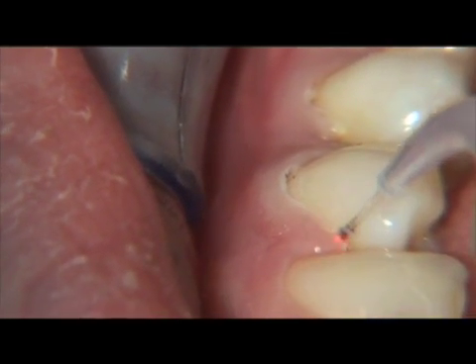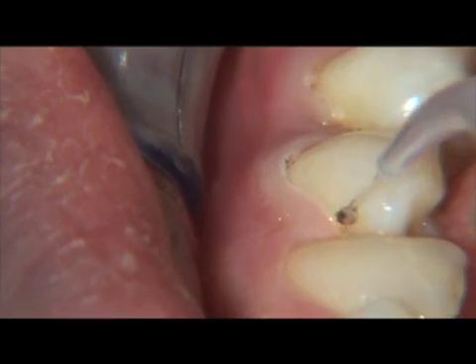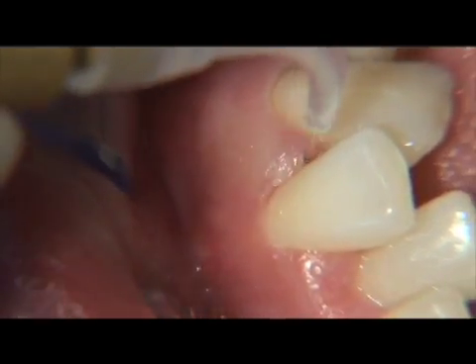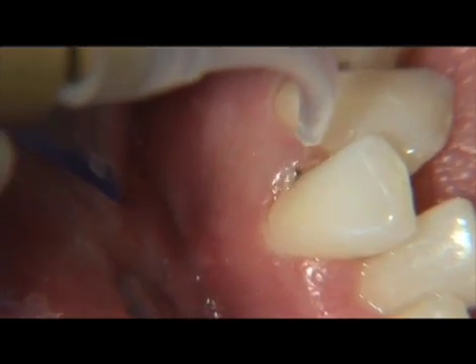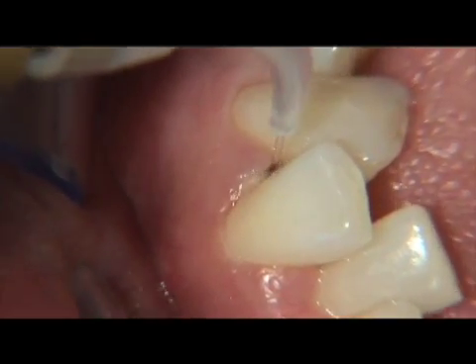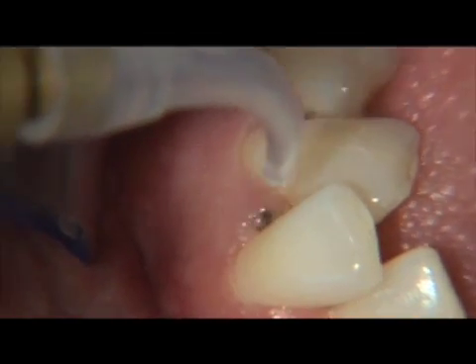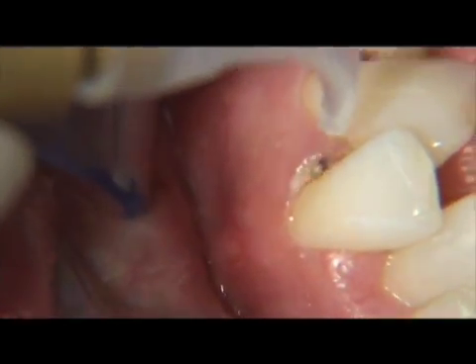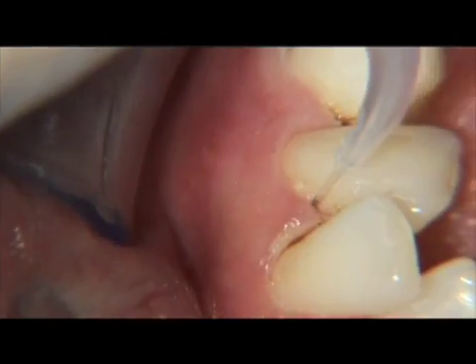Laser curettage can take anywhere between 30 seconds to more than a minute in order to cover the entire circumference of each tooth. The amount of time it actually takes per tooth depends on the depth of the pocket and where the pockets are located. Interproximal areas will take longer than facial or lingual surfaces.